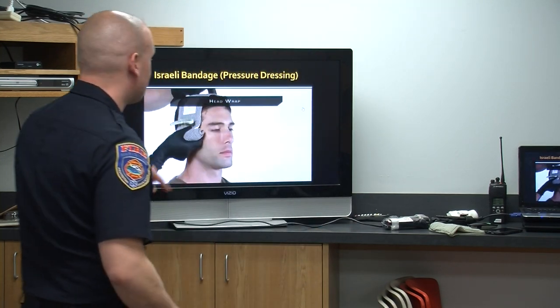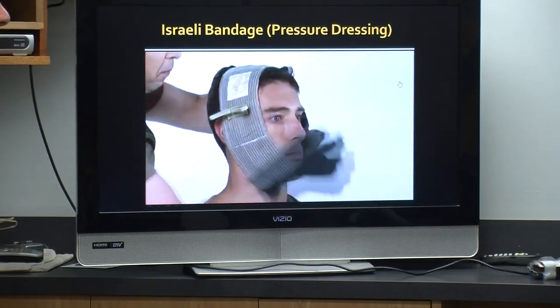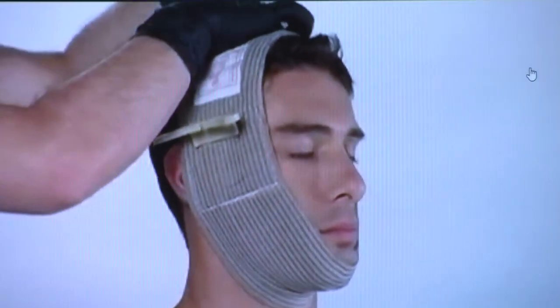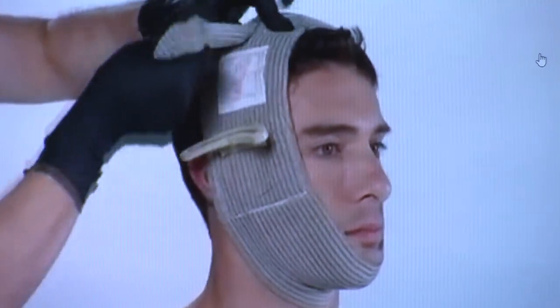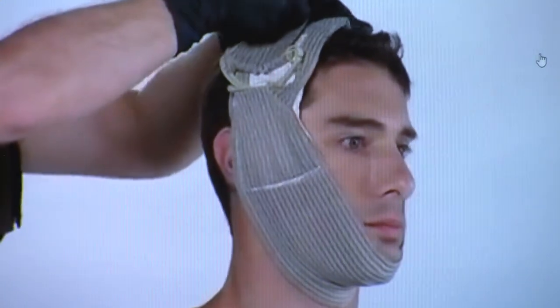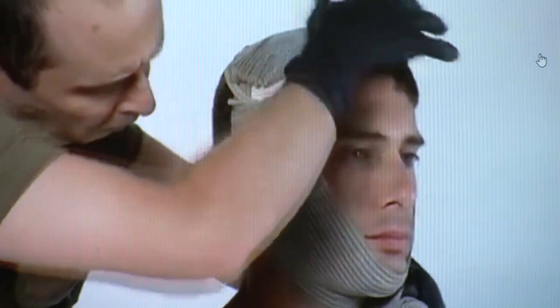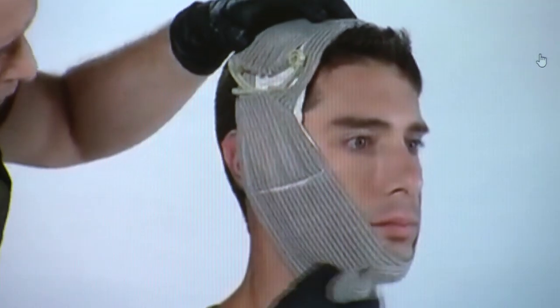Here's the head wrap. Like I said, I haven't had to use it yet on a head injury, but these things are going to work really, really well. Go through the pressure applicator, pull in the opposite direction. And they're cheap. I think they're $8 a piece. That's really nothing.